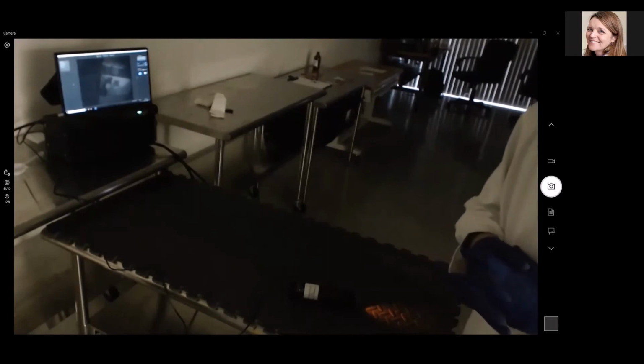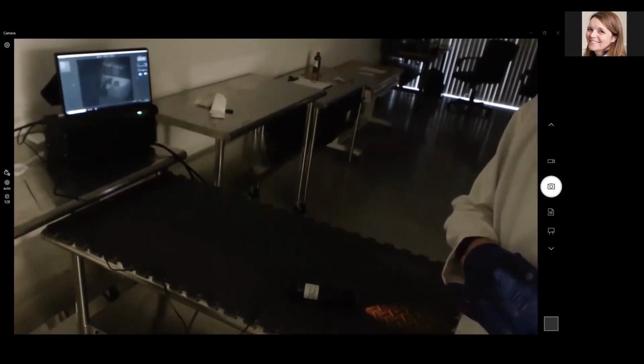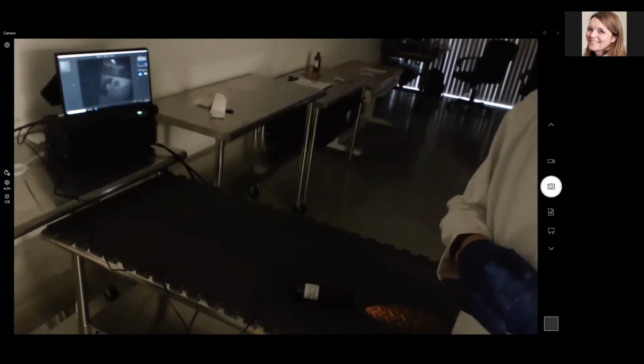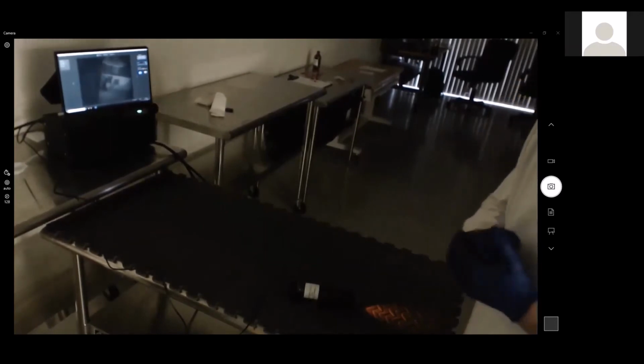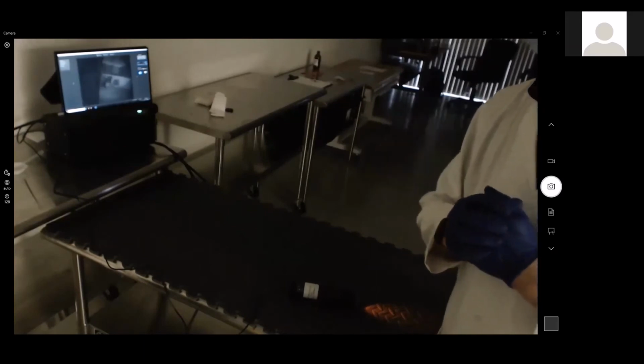The aiming component of some of the other cameras is almost like night vision goggles, right? So whatever the wavelength that is, probably working out there in the high 600s, 700s. Yeah, and I would say that's probably less intense on the patient as well.